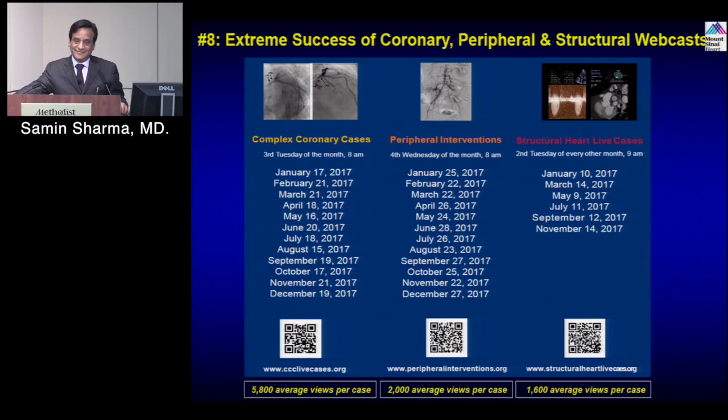The techniques are dynamic, and the way we do rotational atherectomy now is very different than the way we did it 20 years ago, or even 10 years ago when the data were accumulated. So smaller burrs, lower speeds, less contact, more rapidly we exchange the burr for the buddy device. And as I watch your presentation, I see that happening to orbital atherectomy too, lower speeds. Maybe you're going to get a little more conservative about what you do once you've crossed the lesion. Tell me how you think that affects the way we interpret the data that really have been accumulated probably before we do what we do now.